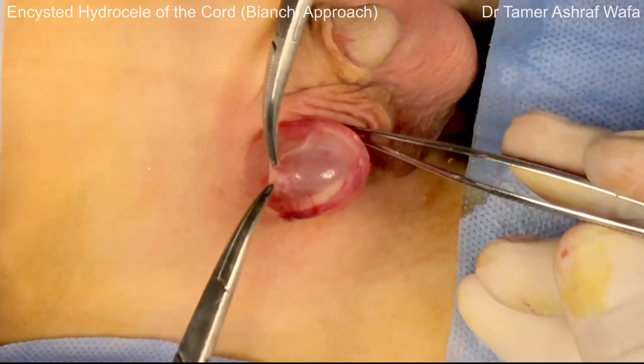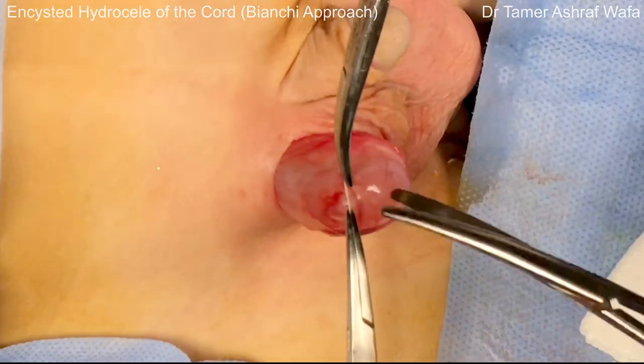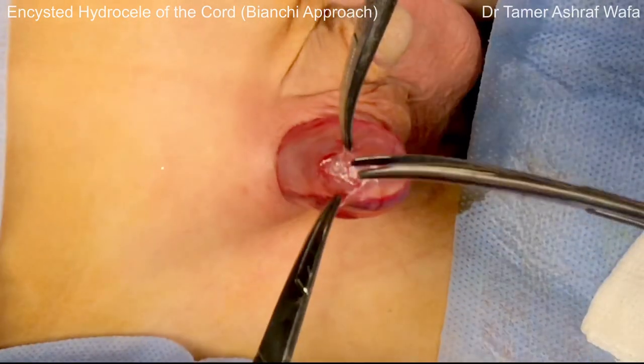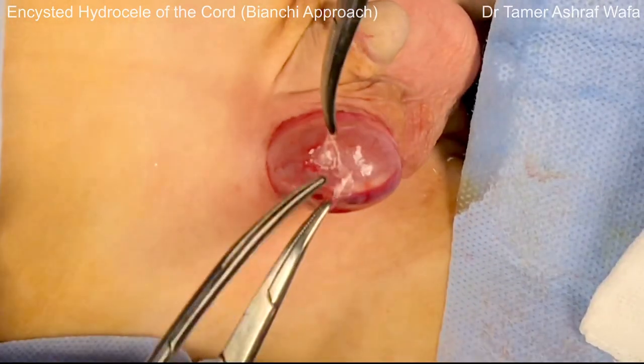Now the hydrocele can be delivered through the wound. The internal spermatic fascia is sharply incised to expose the vas and vessels.